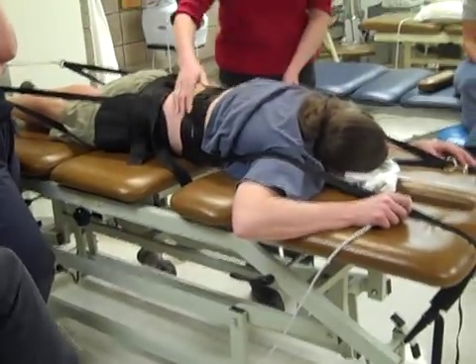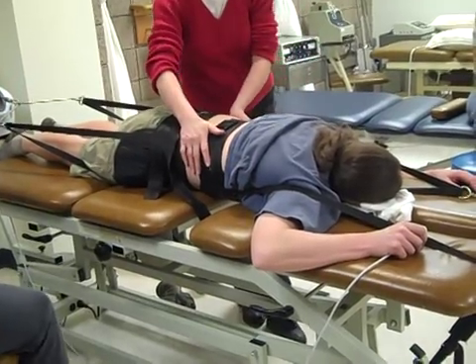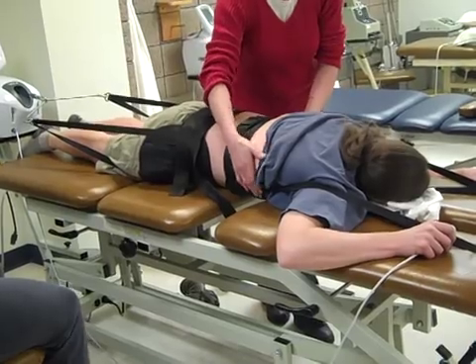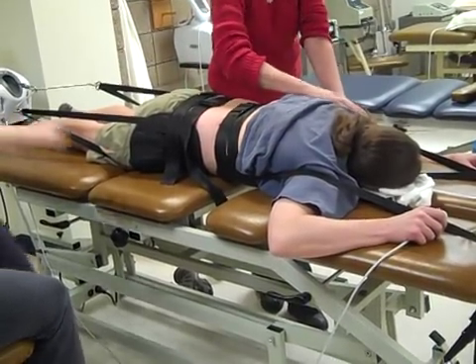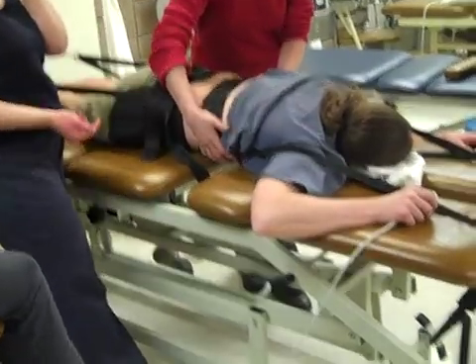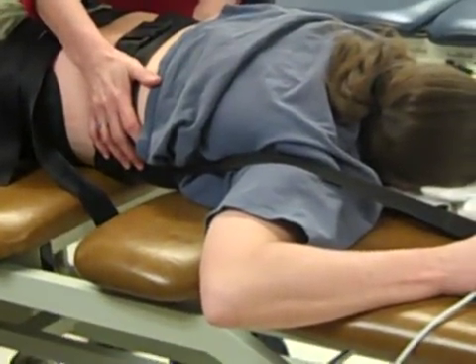Okay, the other thing, these were in a perfect position when they were down here. Now what's happened is they've slid up, because these belts were just a trifle too low. Yeah, look at the position. And he's saying, this isn't comfortable on my arms. Look how it's digging in here. And so make sure that these are on his side and they're tightened down a lot.